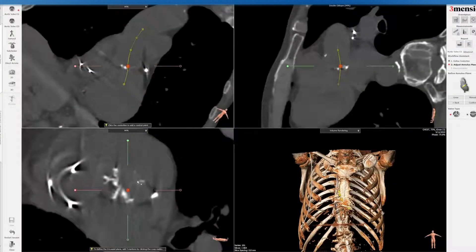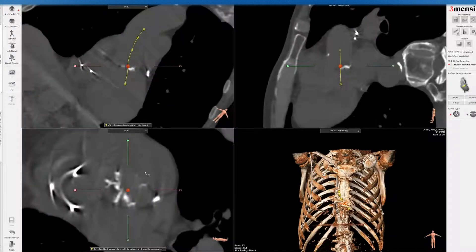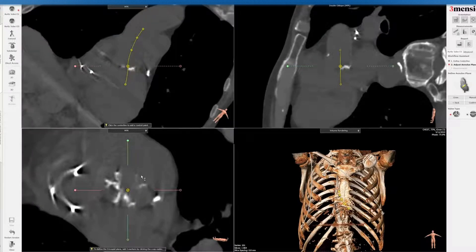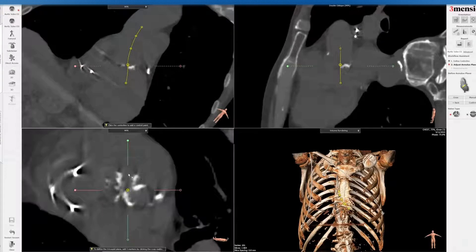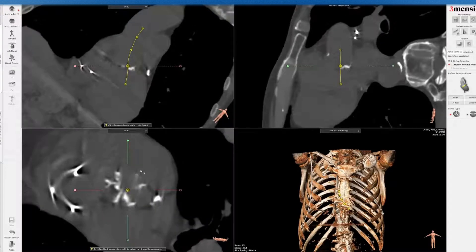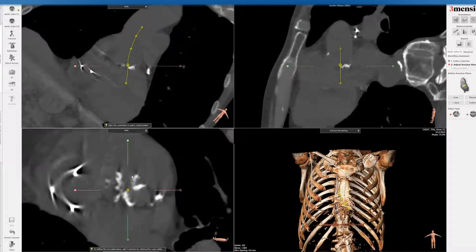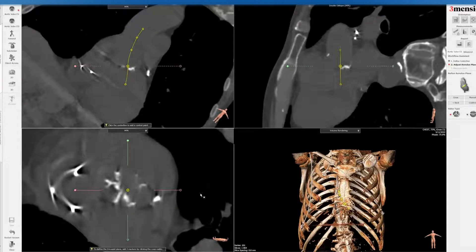One of the other challenges with a non-contrast CT is that it's typically done in a diastolic phase, so the anatomy may be a little bit smaller than in systole. There's also some motion artifact potentially, limiting the ability to accurately measure the annulus.